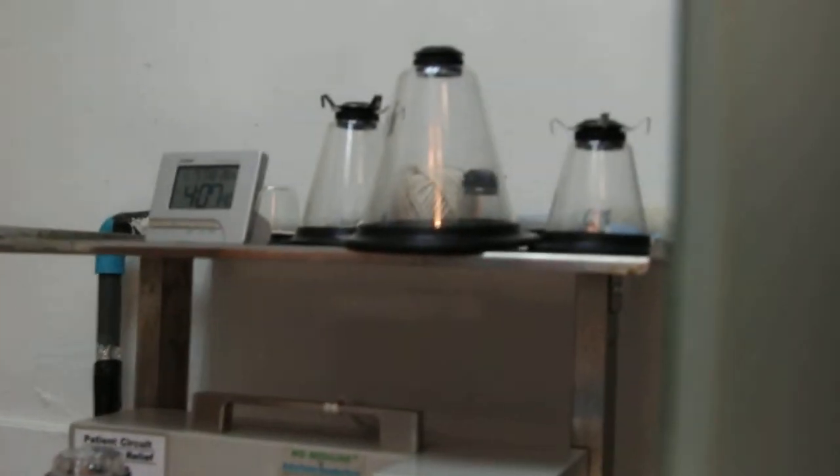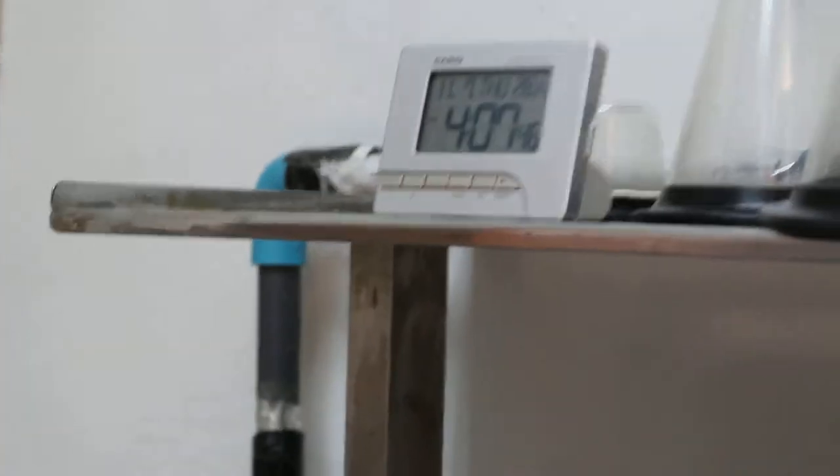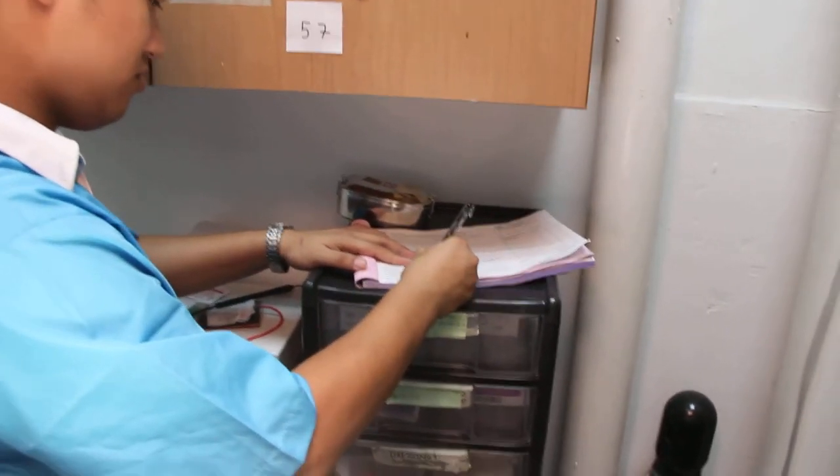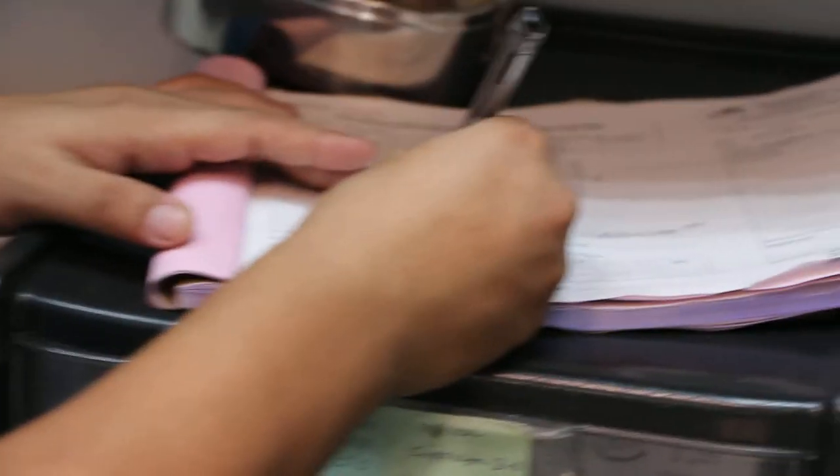And what's the time? So the assistant, record down the time of completion — end of stitching. Record down end of stitching. And so how many minutes does it take from first incision to end of stitching?